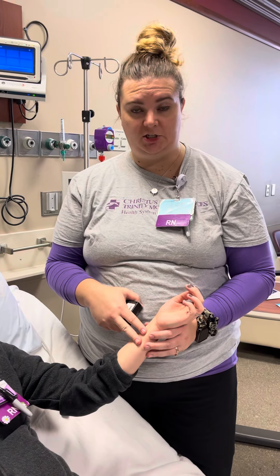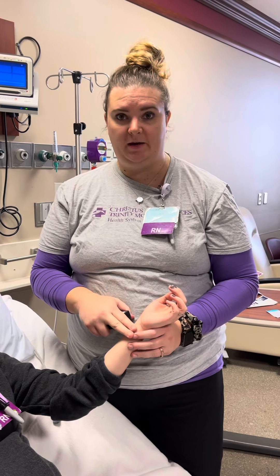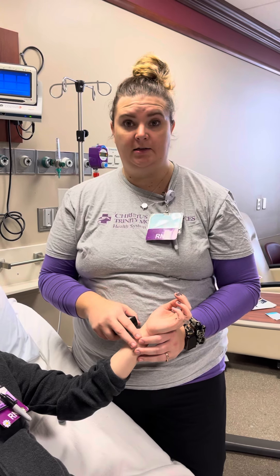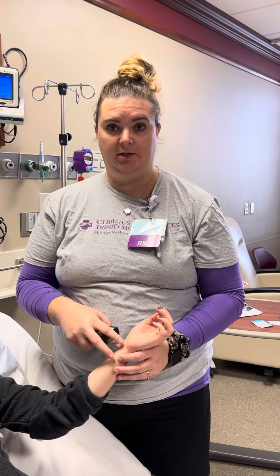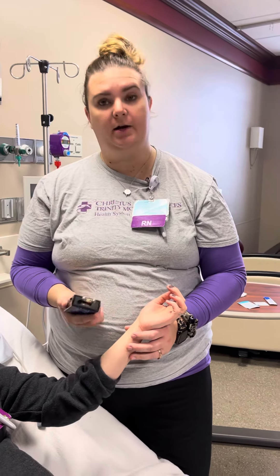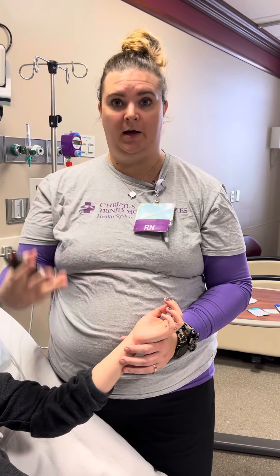Before you initiate a paralytic on a patient you do have to get a baseline train of four, as long as it's safe for the patient. If your patient is crashing and burning and you need to utilize your paralytic, please just go ahead and do it. We can get the baseline train of four later, but if you have time please make sure you get a baseline train of four first, because that is the number you will titrate off of going forward.